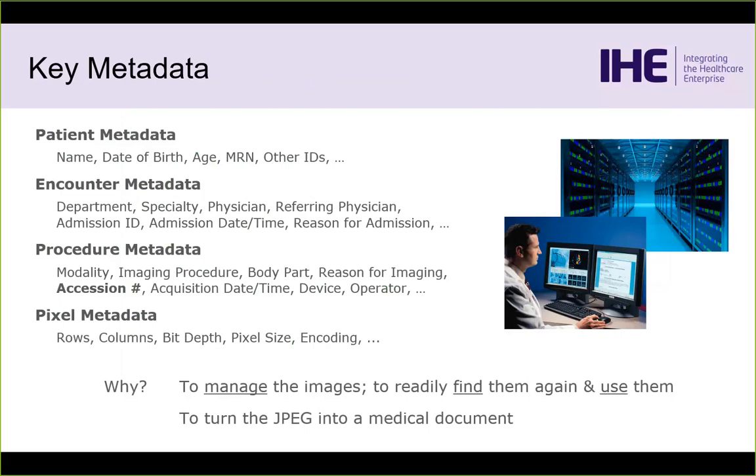You fire them off into the enormous stacks of the data center, and you need to be able to manage the images. You need to be able to find them again. You need to be able to make use of them. Otherwise, it's just a bucket of pixels. And so really that was the focus of the profile, is how do we efficiently capture the appropriate metadata and manage it together.